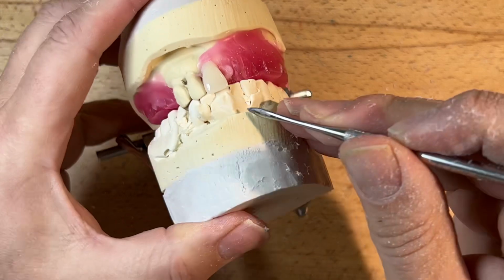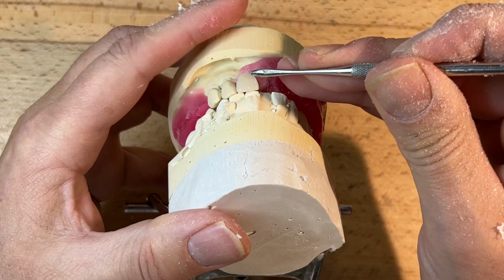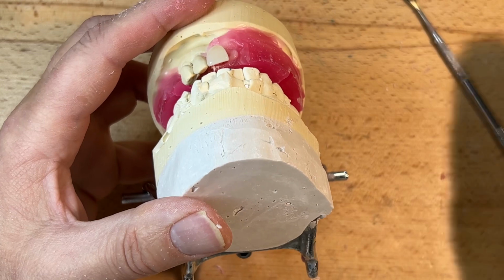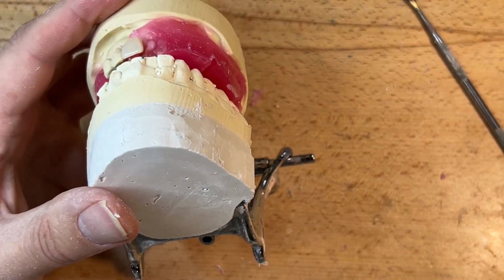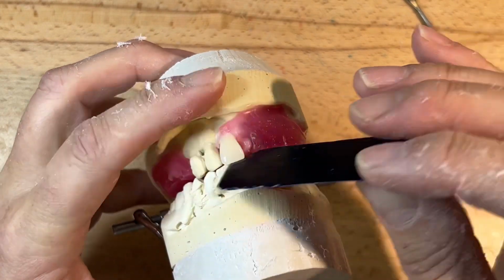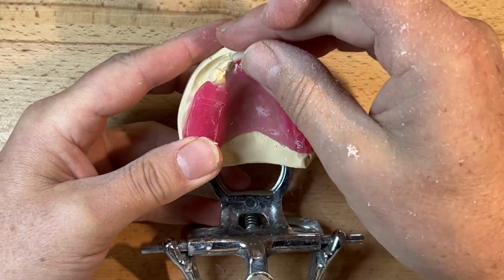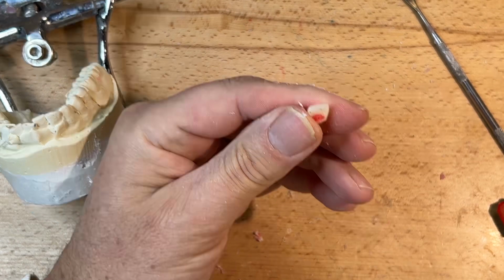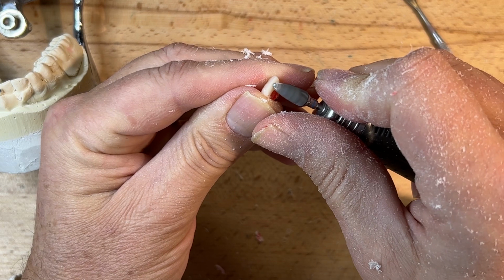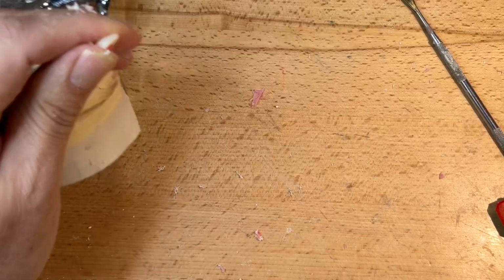Okay, we've got some void, but that's not really a big issue because I could get the incisal edge here still. I've got the midline, and you can see here I'm moving this back and forth, that I may do some selective centric occlusal preparation of this denture tooth. You can see the blue mark here I've left. So maybe to facilitate more contact in centric occlusion, it will disclude in protrusive and lateral. There'll be some selective grinding upon the completion of the denture.